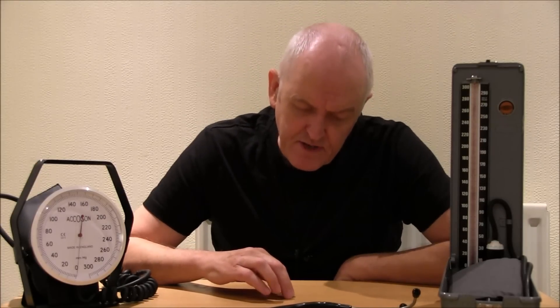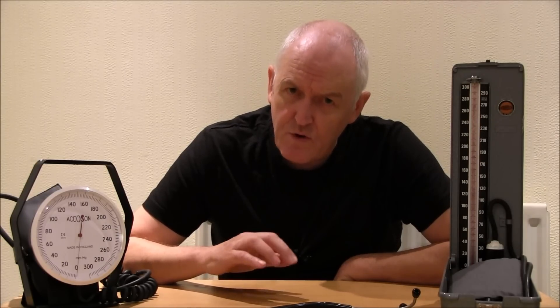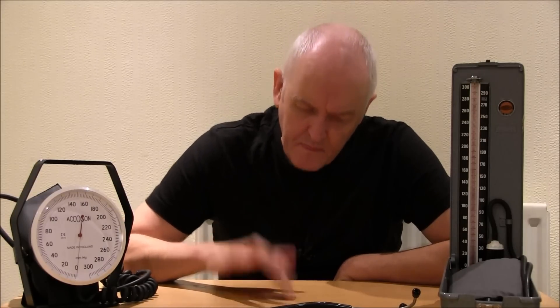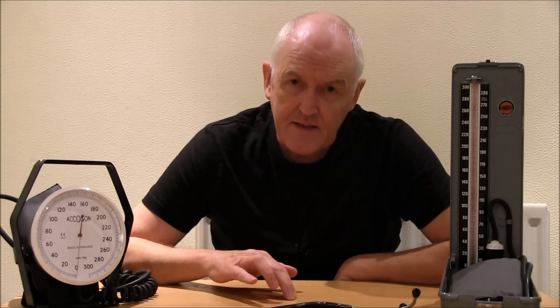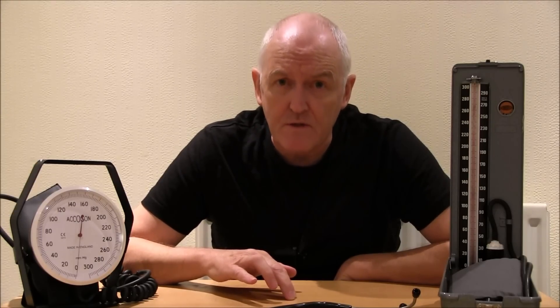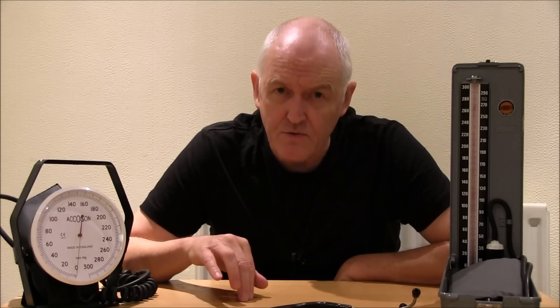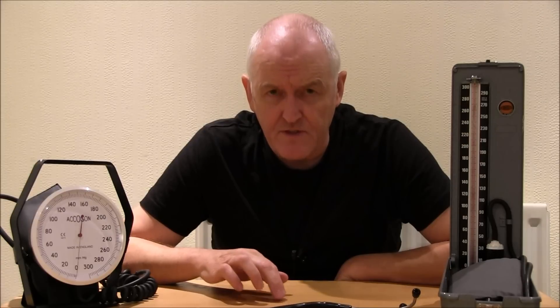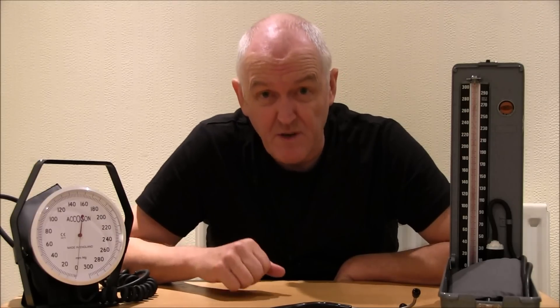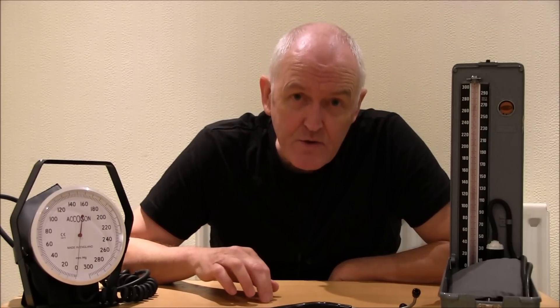Then typically it gets progressively louder — there is a bit of variation in these sounds, but it will get progressively louder. You'll have one beat that is the loudest you hear. Then after that the beat will become muffled, and then it will die away fairly soon — it can be a millimetre or two of mercury after the muffled sound, or as much as 10 millimetres of mercury after the muffled sound, but it will die away.